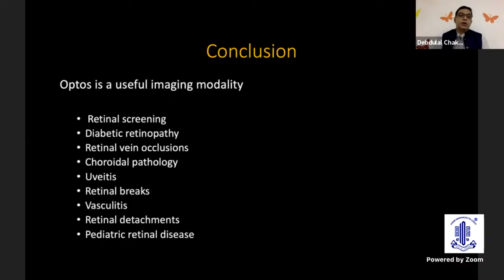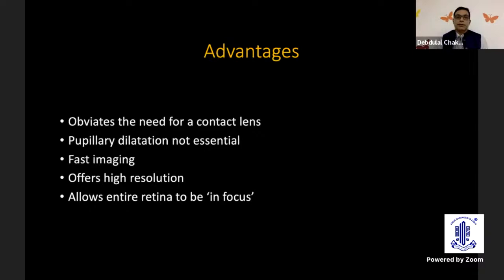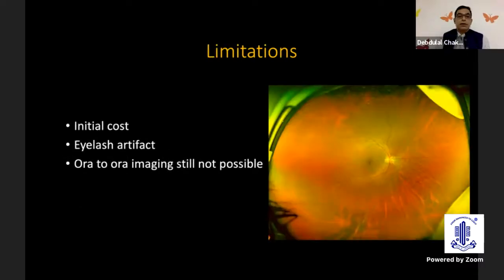And to conclude, Optos is a useful imaging modality which could be utilized in various retinal diseases and of course in uveitis also. And it obviates the need for contact lens. Pupillary dilatation is not really always essential. The imaging is fast, it offers high resolution, and allows almost the entire retina to be in focus. But the problems are the initial cost, and often you have these eyelash artifacts, and ora to ora imaging in all quadrants is still not possible in one go.